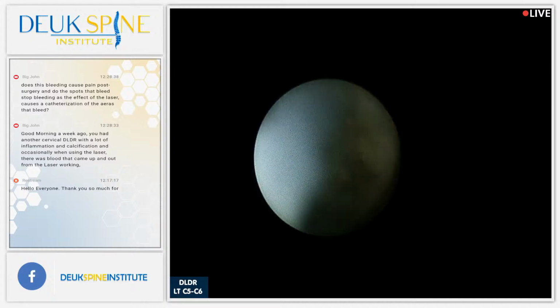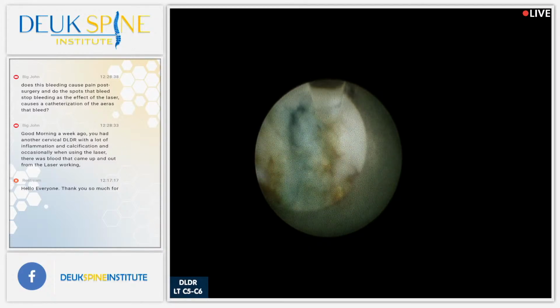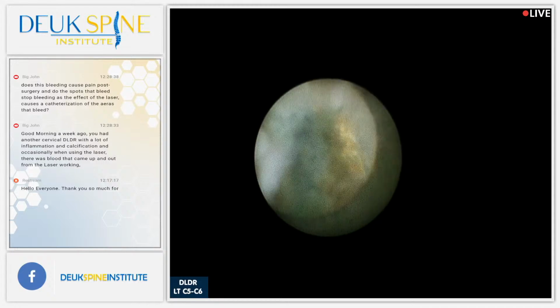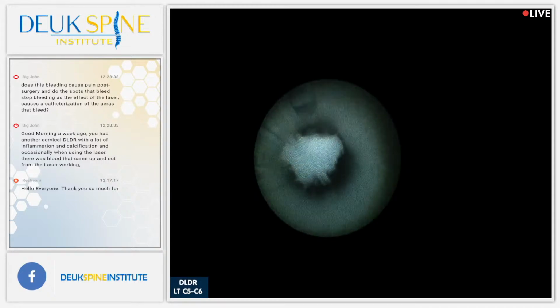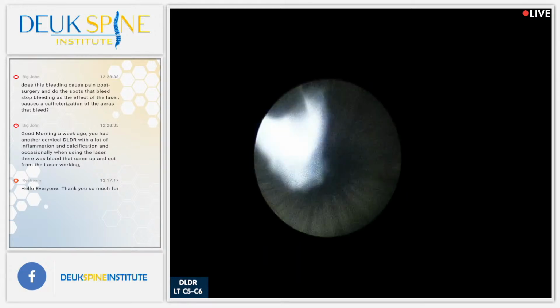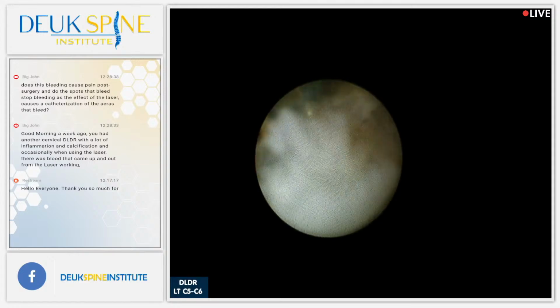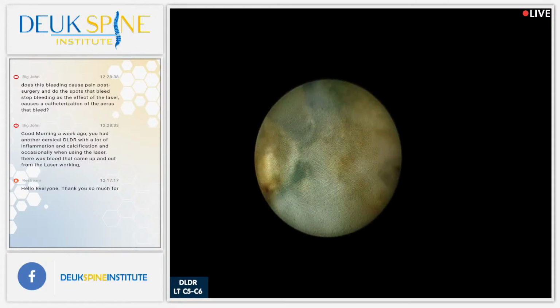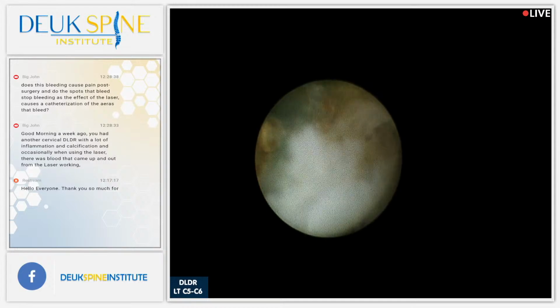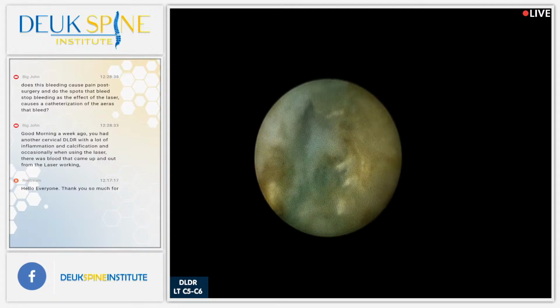Anyway, any questions from the audience about the spine? Yes, this question comes from Big John on YouTube. Big John! They ask, good morning. A week ago, you had another cervical DLDR with a lot of inflammation and calcification, and occasionally when using the laser, there was blood that came up and out from the laser working. Does this bleeding cause pain post-surgery, and do the spots that bleed stop bleeding as the effect of the laser causes a cauterization of the areas that bleed?